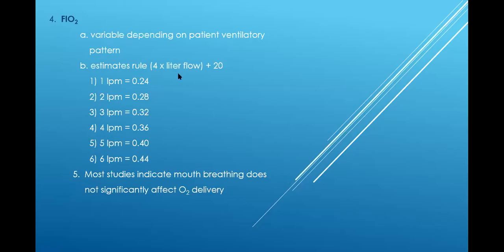Now that's the rule. Any questions on the rule of fours? No, not on the rule of four, but is a nasal cannula and a nasal catheter the same? No, they're not the same. I'm gonna tell you all of the steps. Oh, okay.